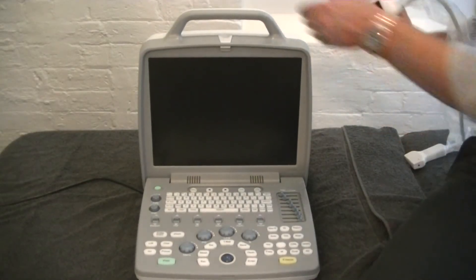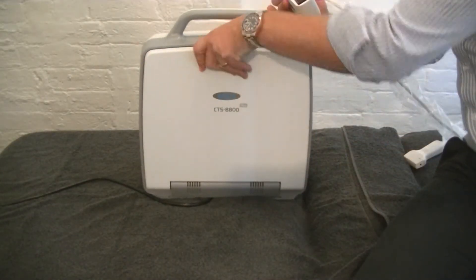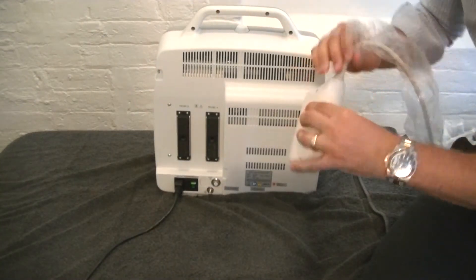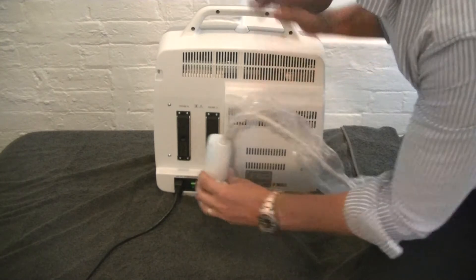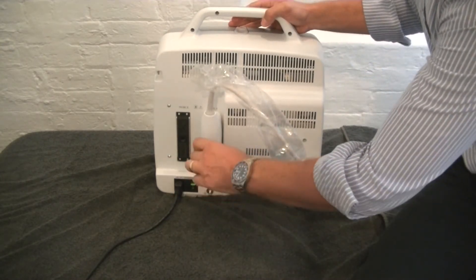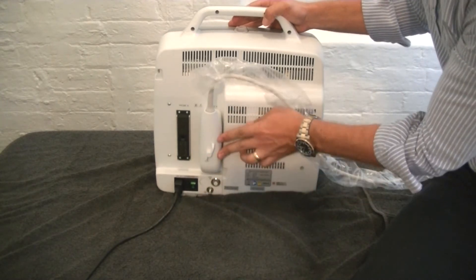To get started, plug the probe into the back of the unit. Keep the cord facing up and slide it into the probe connector, then turn the knob clockwise to secure it.